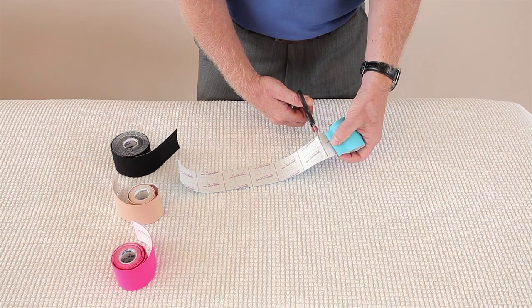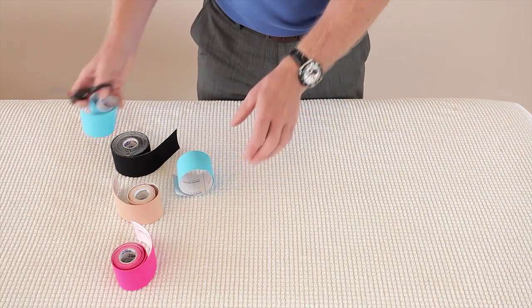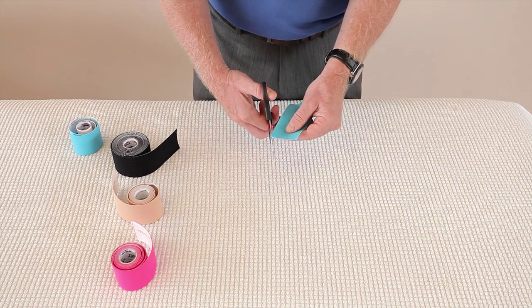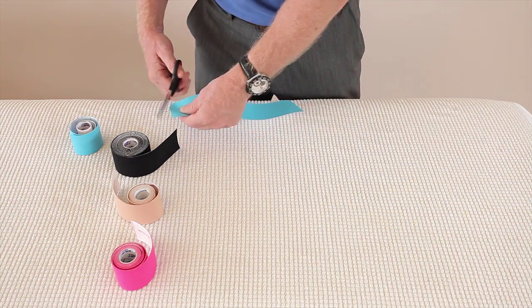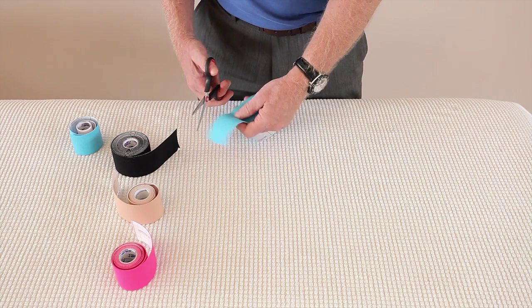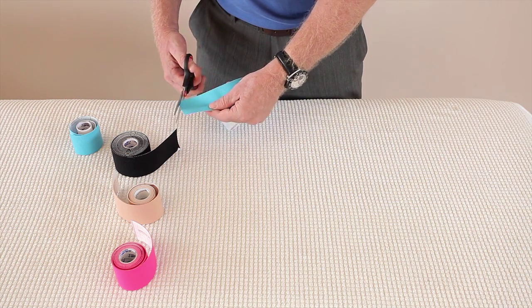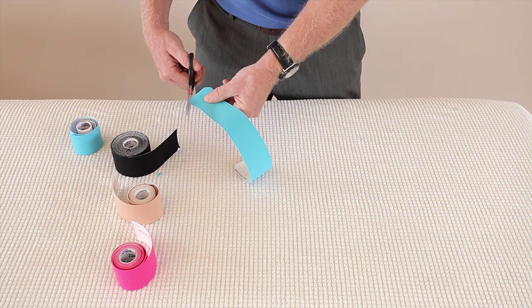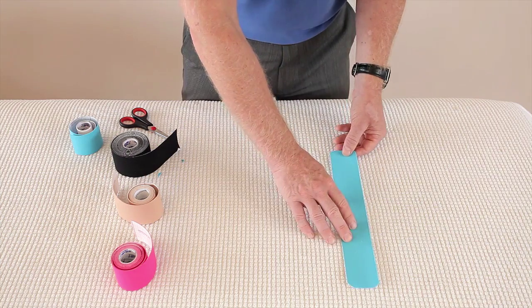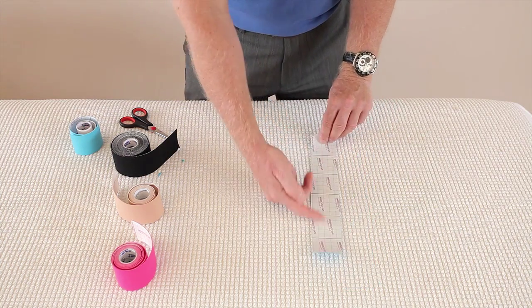I'll just literally cut that along its line, and that would be a standard eye strip. What I need to do is round off the ends to stop it from lifting. So I'll just round off each of the ends, because you tend to leave a tape on for between 3 and 5 days — if you've got a corner, it tends to cause a lifting effect. So that's one standard eye strip, that's 6 squares.